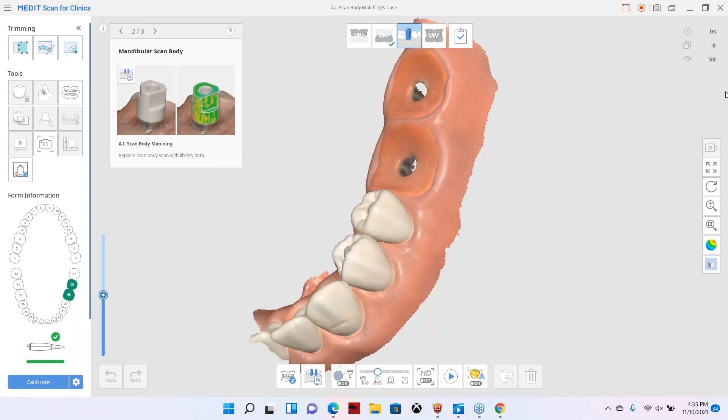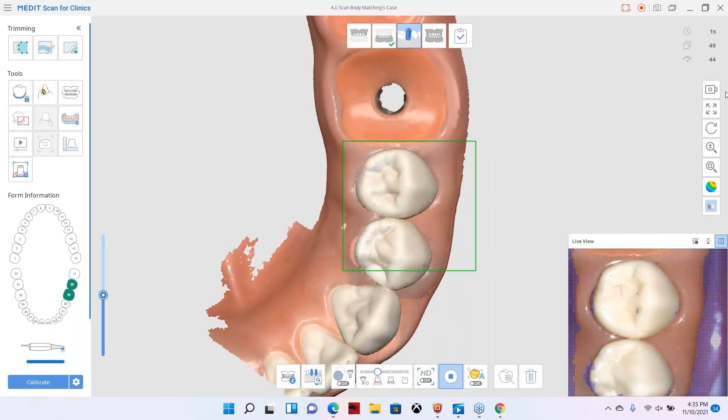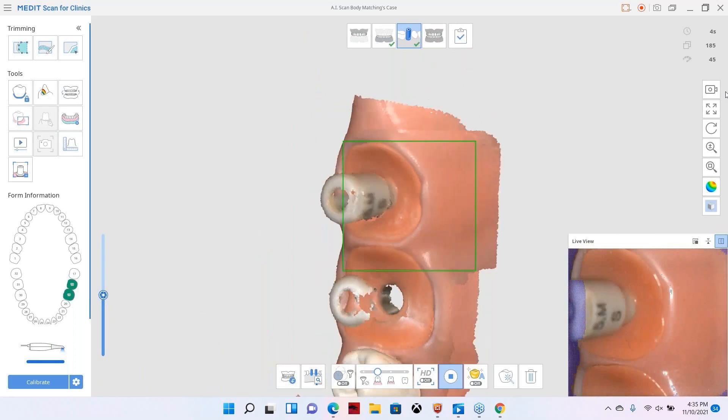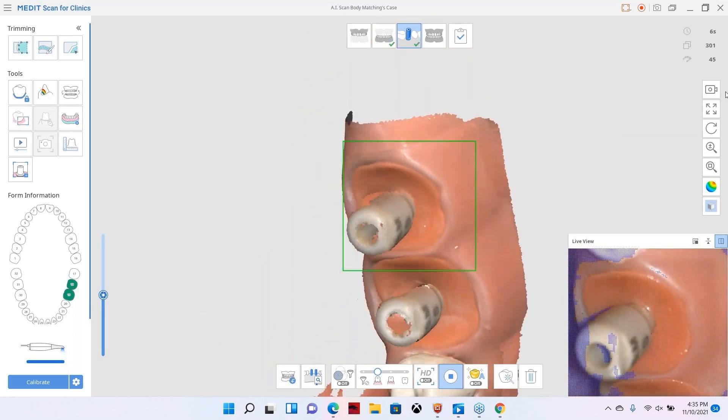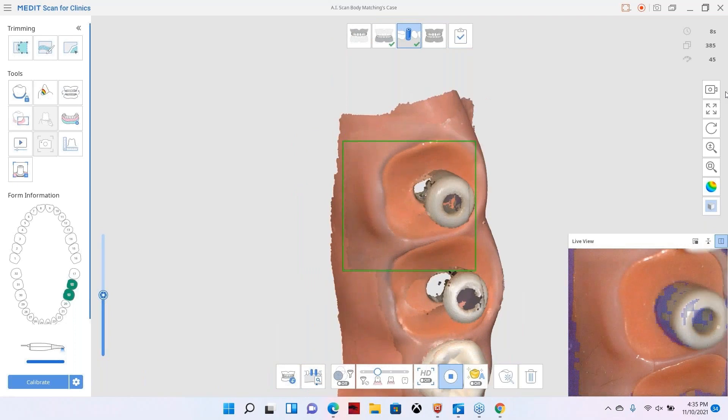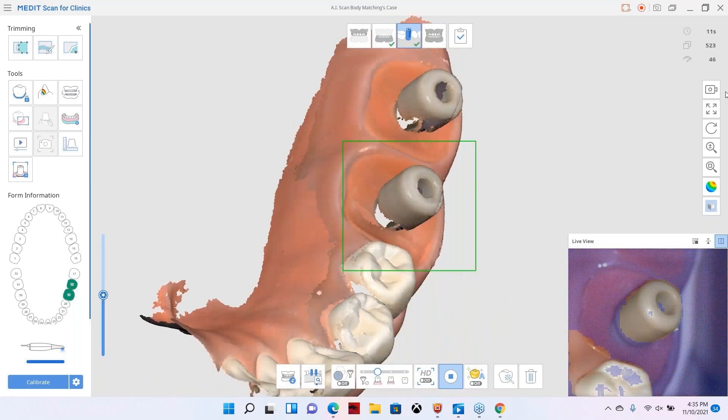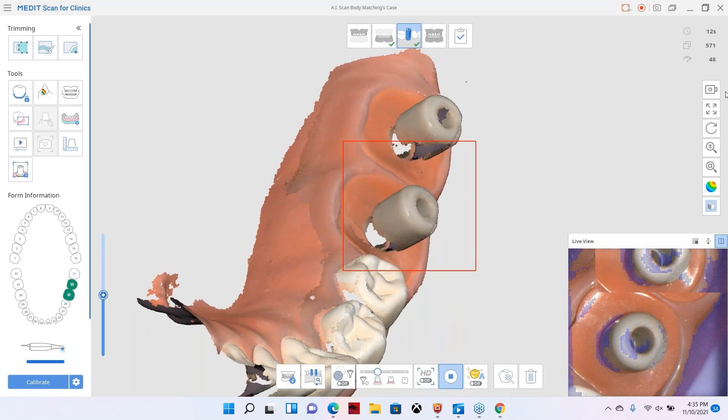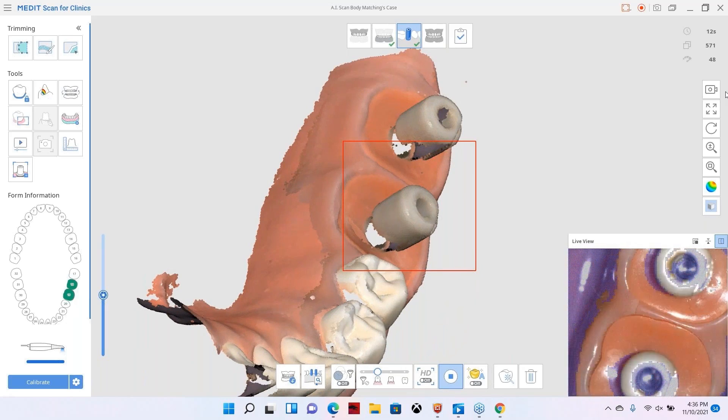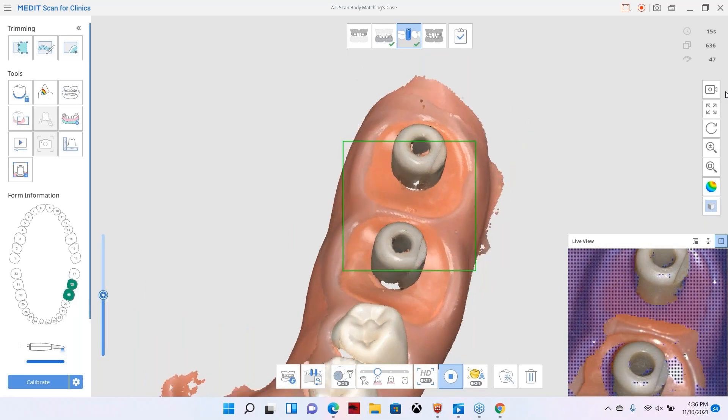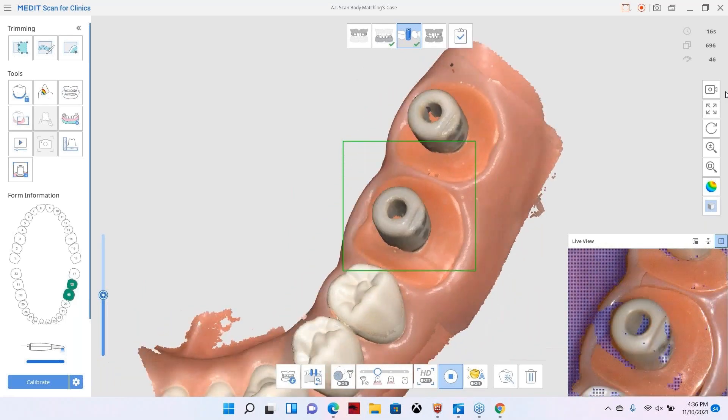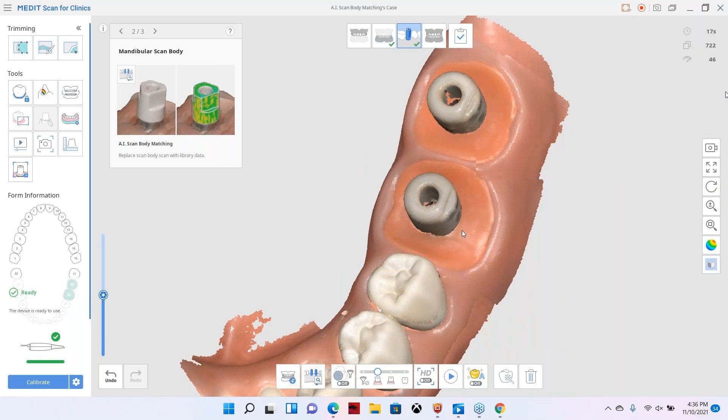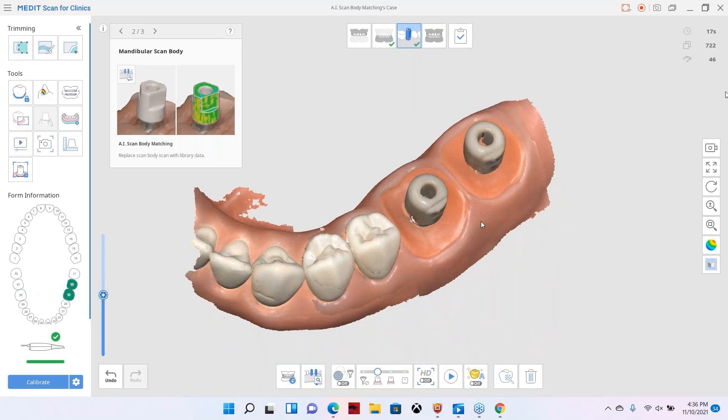What I'm going to do is place these scan bodies and then together I'm going to scan both scan bodies. And this is where you see that update coming into play. I don't have to select each specific scan body site or implant site. I can go ahead and scan these scan bodies together. We've got off track there just a little bit, we'll just go ahead and get back on top of those scan bodies, pick up the mesial and distal. Let's go ahead and take a look at these, see what our scans look like here.